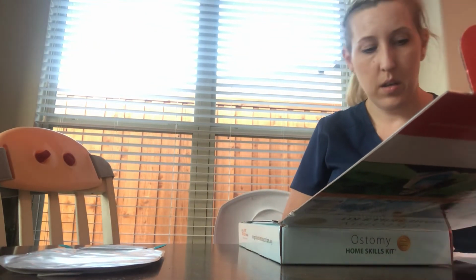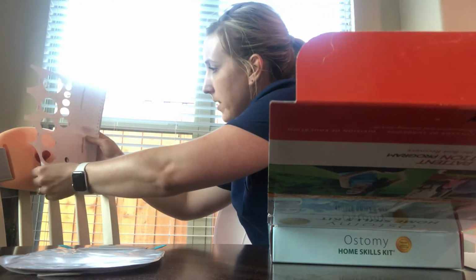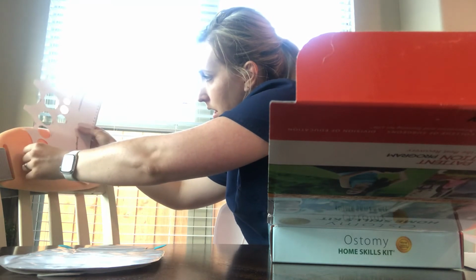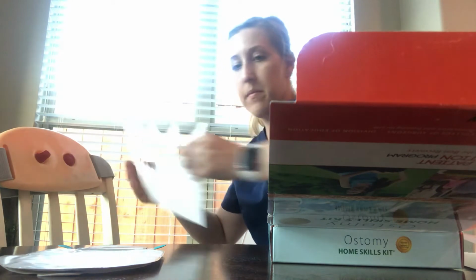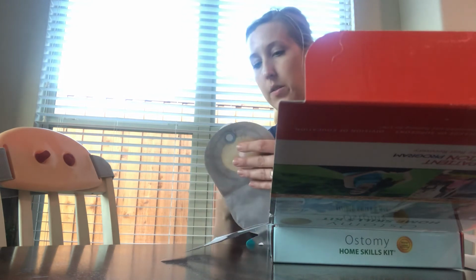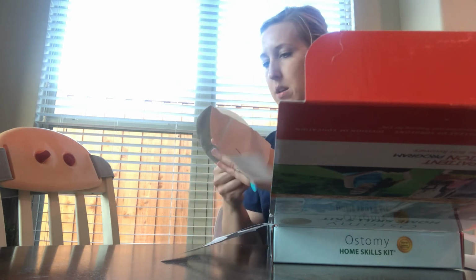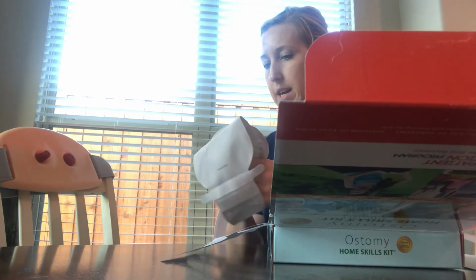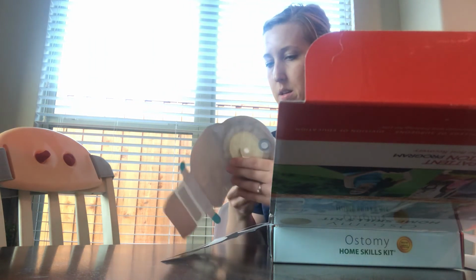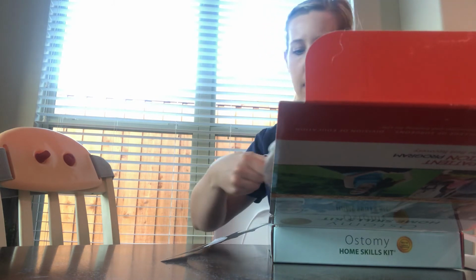Then you're going to take your stoma guide measuring, and you're going to measure to see about how big. And you're going to want to cut yours at about a 30. So then what you're going to do is on the back of this Coloplast bag, it shows 15, 25, and then there's a little line for 30. So you're going to cut up and around, and you're going to be careful not to poke through the bag. So you're going to cut all the way to the 30 and get that done.